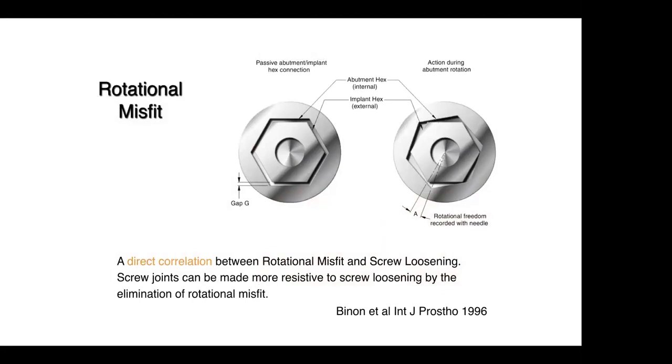There's a reason though. There's a thing called rotational misfit, which is basically a structural misfit or freedom created during the manufacturing process.